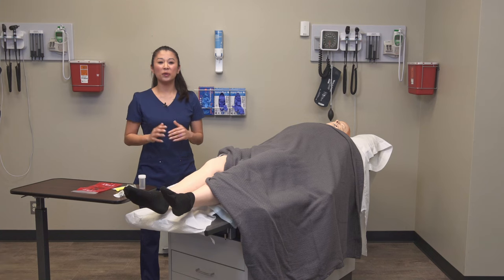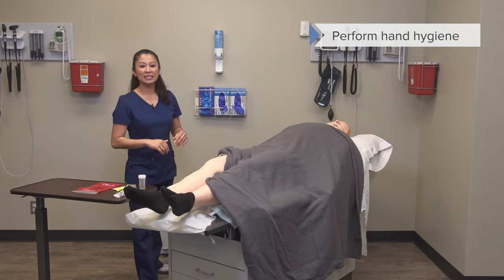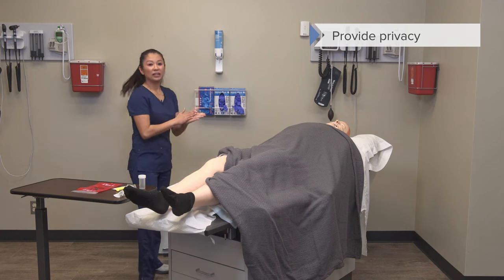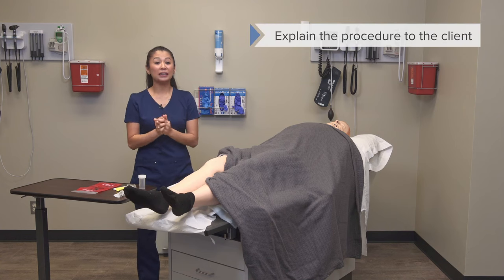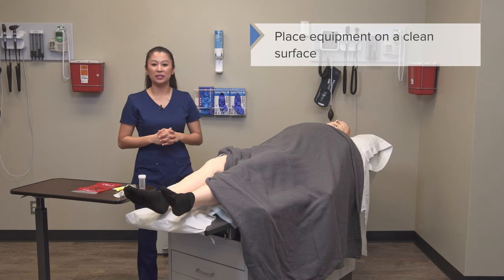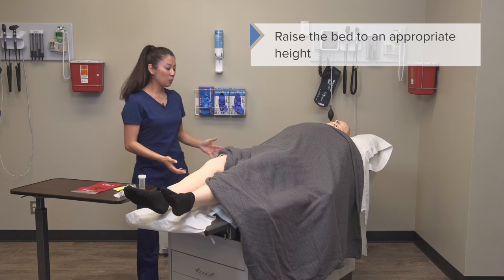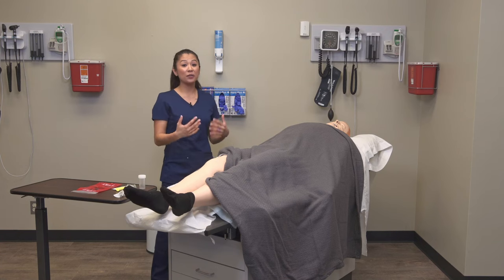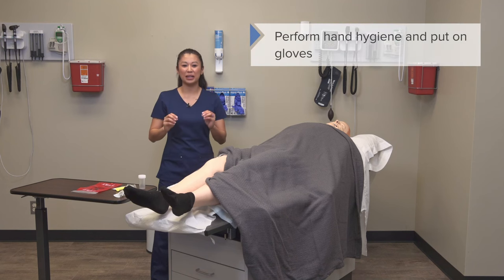Let's talk about what we need to do to get started. We want to perform our hand hygiene and provide privacy to our patient. It's always important to explain the procedure to the patient and get your equipment ready on a clean surface. Make sure before you start, you raise the patient's bed to an appropriate working height. And now that I've touched the bed, I want to perform hand hygiene again and put on gloves.